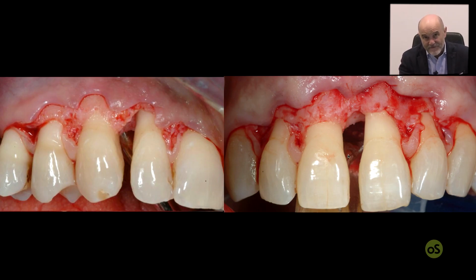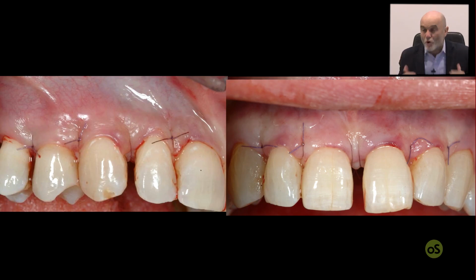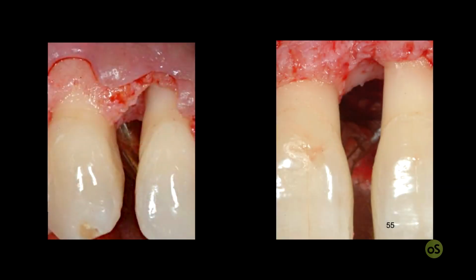Now you have the opportunity to anchor your flap, which is an envelope flap, to the 1, 2, 3, 4 desepithelialized papillae in a more coronal position, and at the same time the supracrestal soft tissue closing with the split thickness surgical papilla is exactly at the same level of the most coronal extension of the adjacent anatomic desepithelialized papilla.